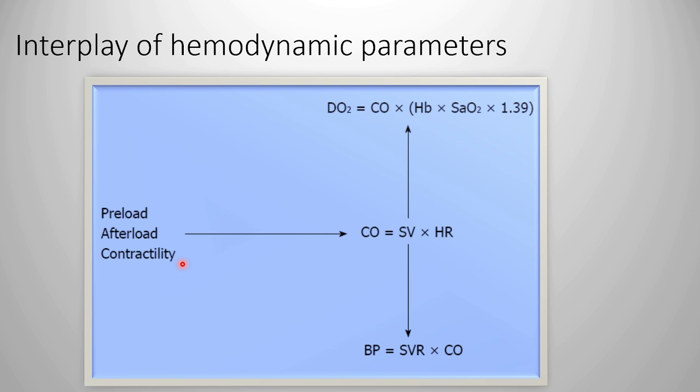We can also have some advanced cardiac output monitoring devices and various types of monitors which can give you cardiac output and other parameters like stroke volume variation, systemic vascular resistance index, wedge pressures, and everything depends on whether you are using, say, a pulmonary catheter, thermodilution, other modalities, or some non-invasive monitors like electrical cardiometry. Blood pressure we can measure by non-invasive or invasive intra-arterial blood pressure.